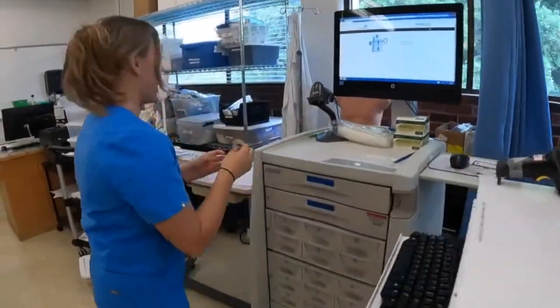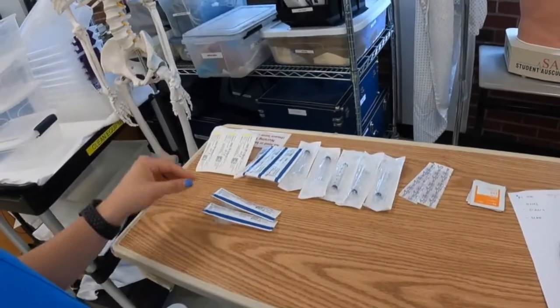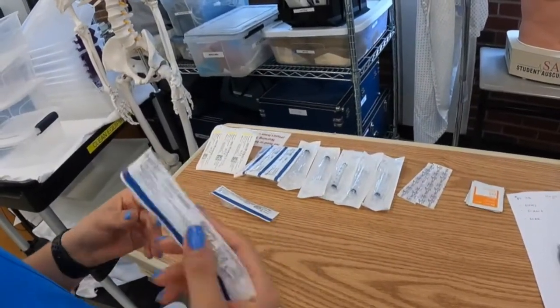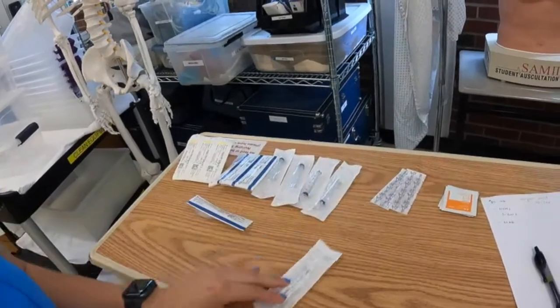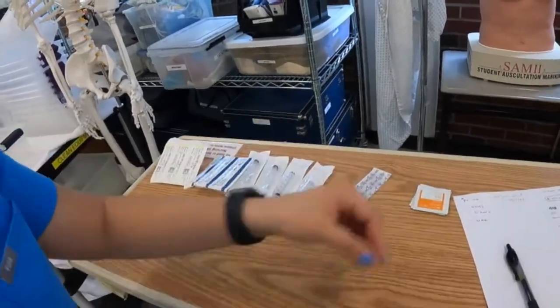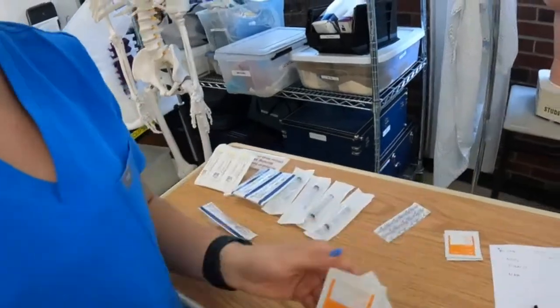Here I have what my supply room would look like. I'm going to get a 23-gauge needle — we have multiple options — and then a syringe, a band-aid just for bleeding, and a few alcohol swabs for cleansing.